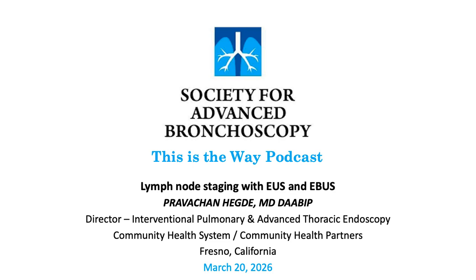Also, the right adrenal cannot be accessed in most patients with the EBUS scope in the esophagus through that route, because most of the time you have to go through a transduodenal approach, and you need a conventional EUS scope for that. But in most mediastinal stations, there's no difference between the use of the EBUS scope in the esophagus versus the conventional GI EUS scope.